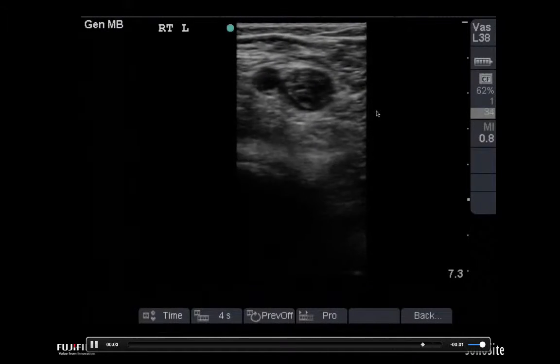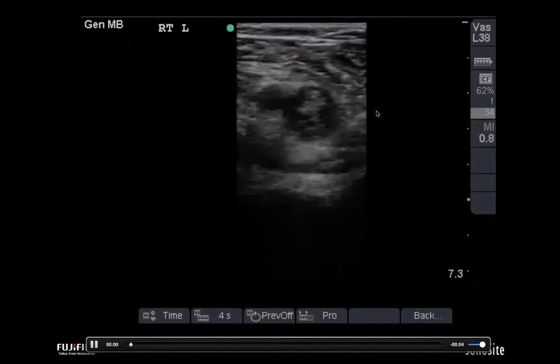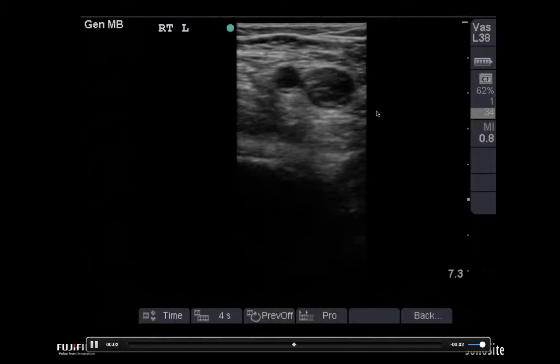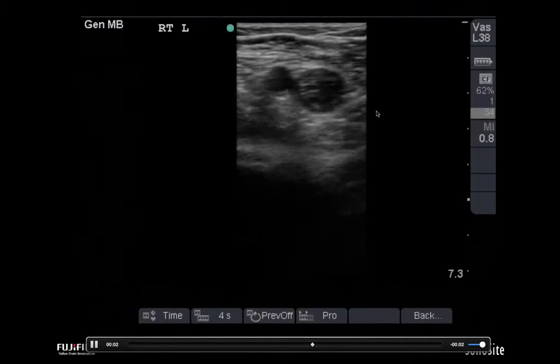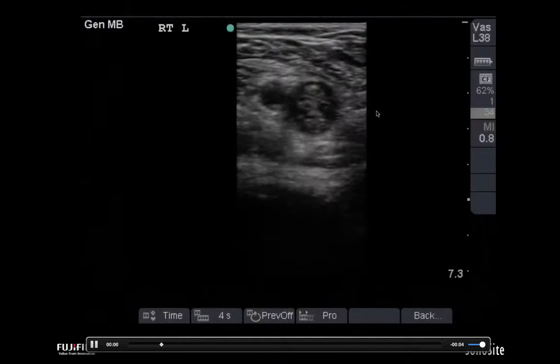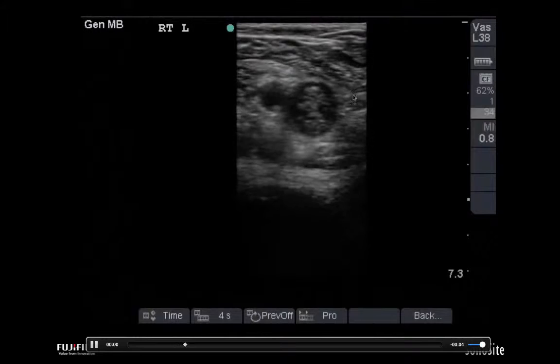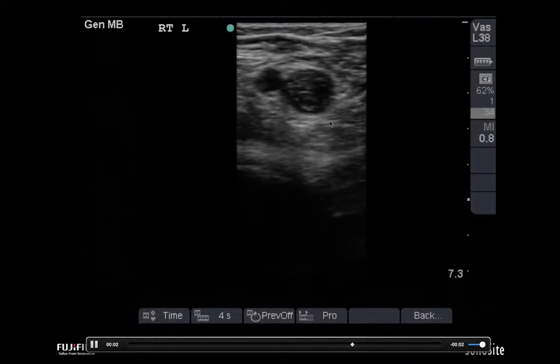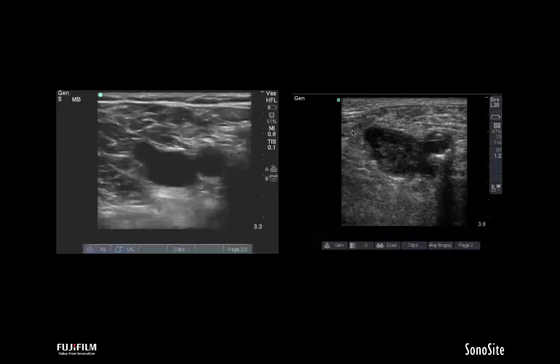I would also add that this is unmistakable. This is really a very clear example of it, which it often is in the case of deep vein thrombosis, because again, the vein is so easily imaged in most patients. It's full of blood, which is a fluid, which is ultrasound's friend. When you see soft or echogenic material within the vein, it becomes easily identifiable.